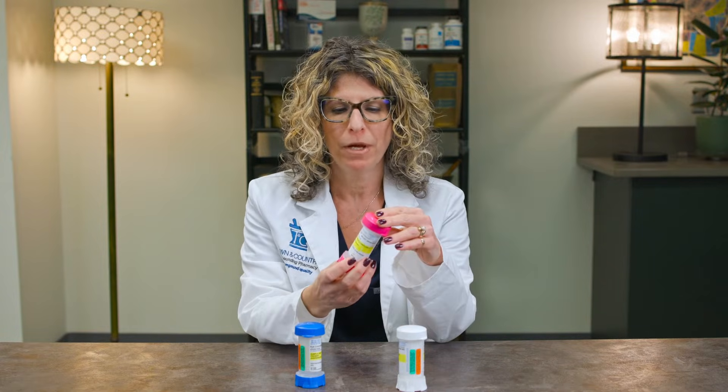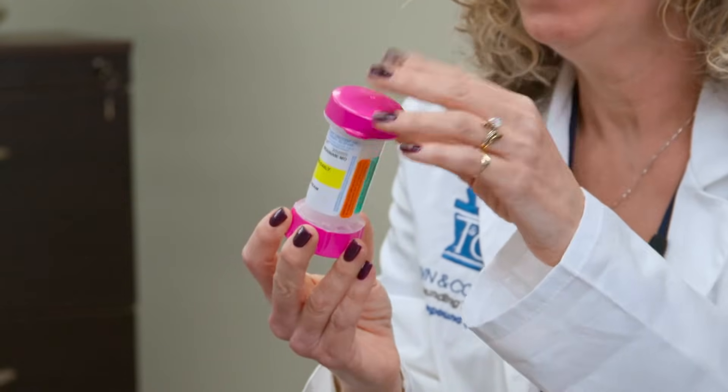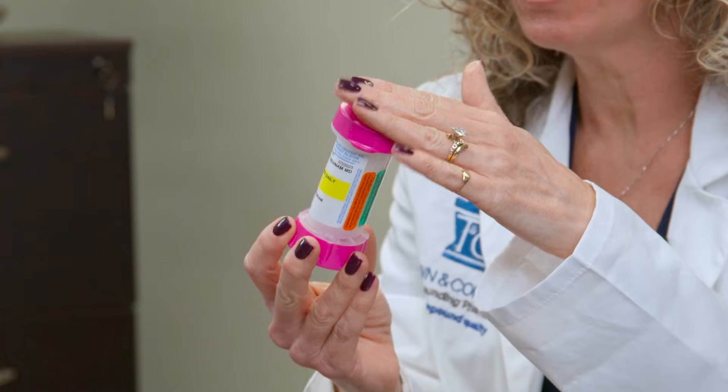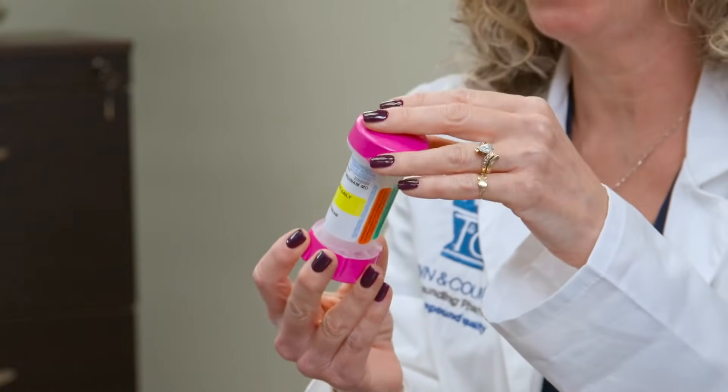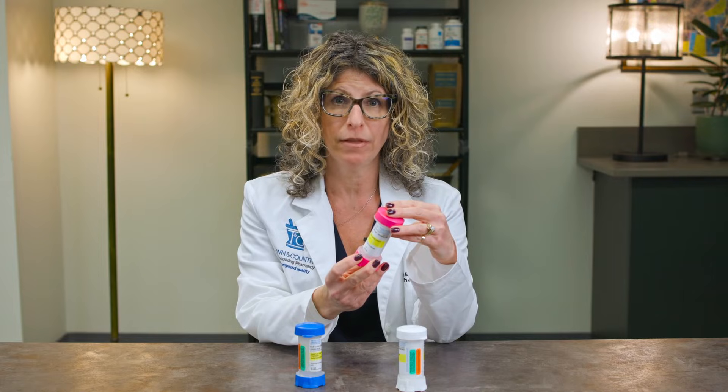When you receive hormone therapy, you're probably going to receive it in a device very similar to this one. It could be one of several colors — pink, blue, or white are the most popular — and the directions are specifically indicated on the device itself.